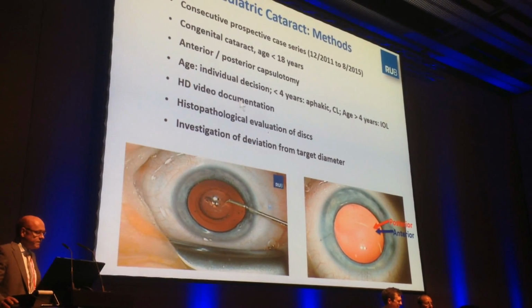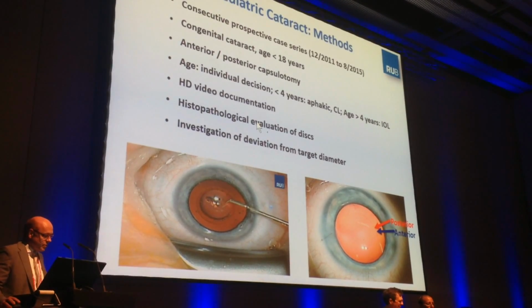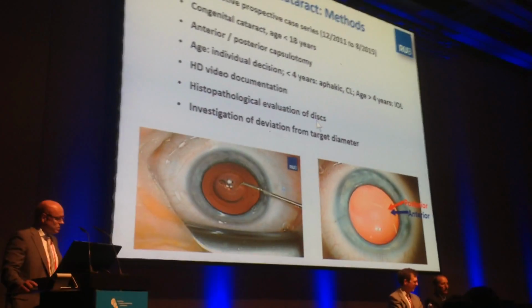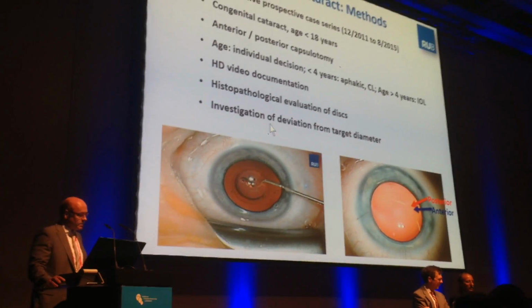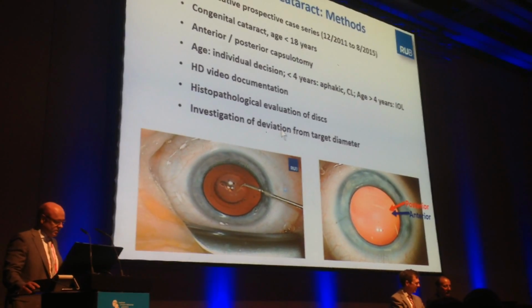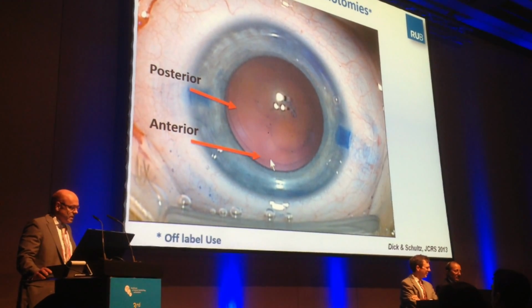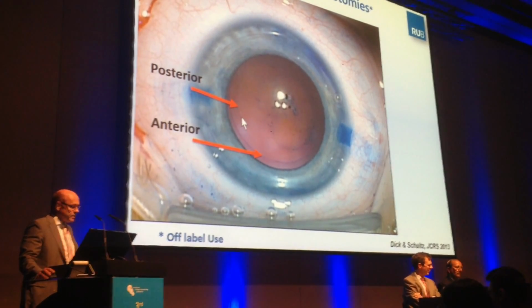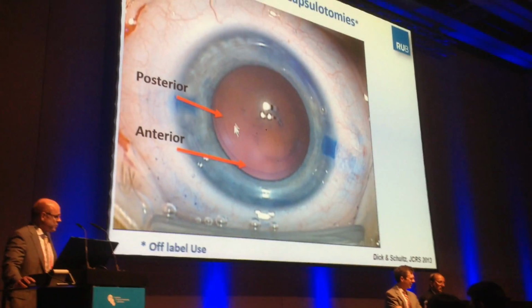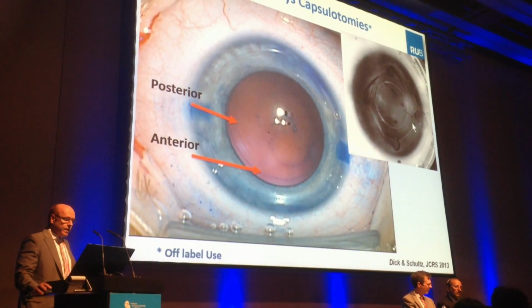We are doing HD video documentation in every case, and every case is histopathologically investigated by my co-author, Dr. Tim Schultz, who looks at everything as a co-pilot, so to say, and then we investigate the deviation from the target diameter. And this is one of the initial cases where you see here the anterior and here the posterior capsulotomy, but this is too wide already. So we recognize that this is, by the way, a Mittendorf ring here after docking.